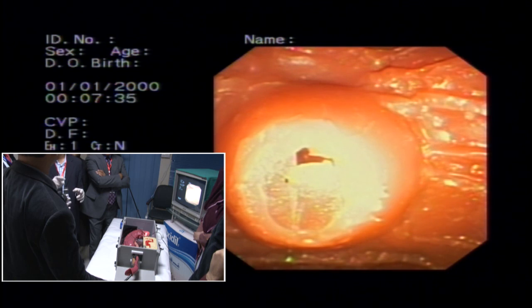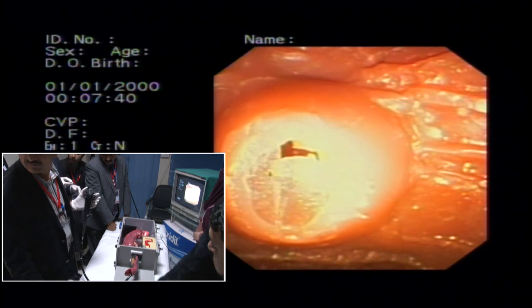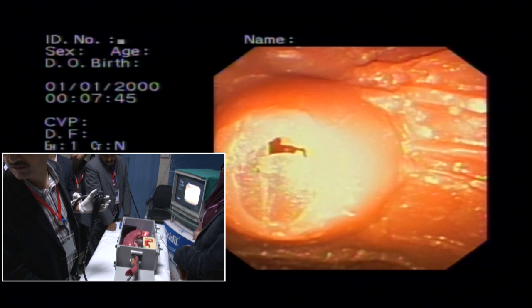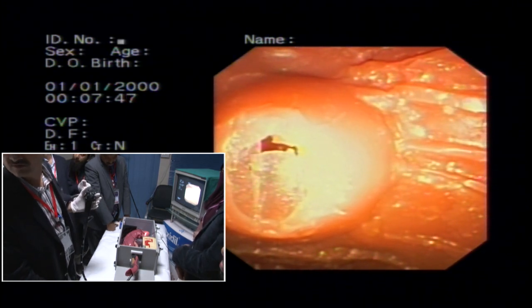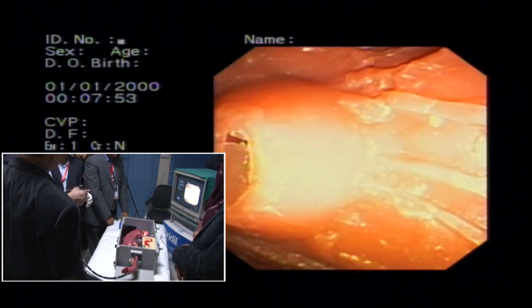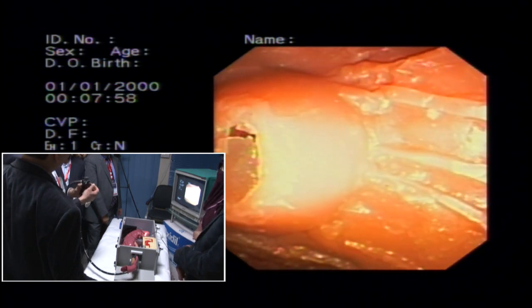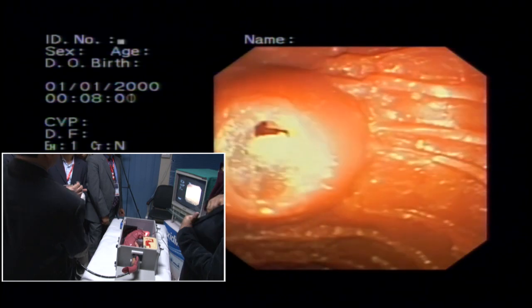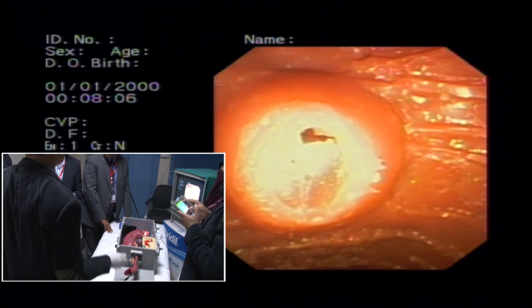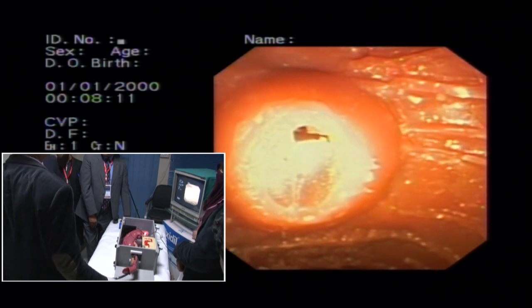Sir, one of my teachers in Japan told me that while shortening, make the tip up and then right, and then do shortening. Like first you tip up and then right. मतलब usually ये होता है कि आप right lock करके, and then you pull out। तो जब pull back करते हैं तो उस वक्त आप tip up करते हैं। दूसरा थोड़ा सा आप जब ये करते हैं तो you move your body toward the right, that will give you an advantage.